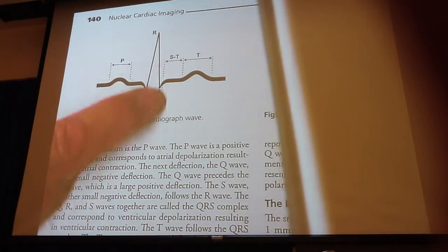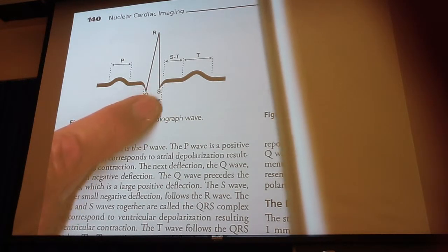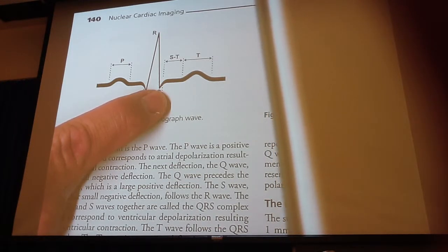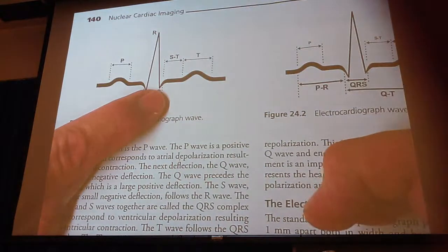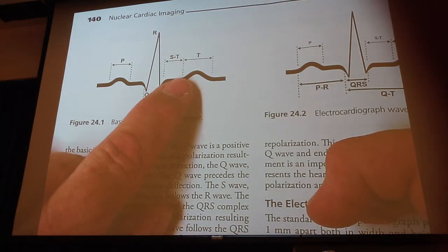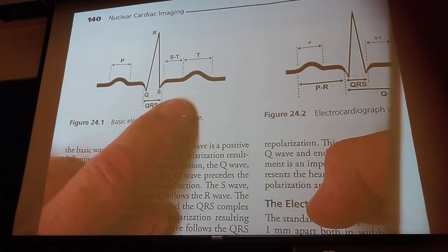And then when we get down here, what's happening in the ST segment? Depolarization? Or you mean repolarization? It starts. Okay, yeah, we've just concluded the maximum electrical activity, so now we're pumping out the sodium and replacing it with potassium. So that's what's happening here. And again, if you have poor perfusion, this is going to be extended. Or if you have ischemia, you're going to see a depressed ST segment.